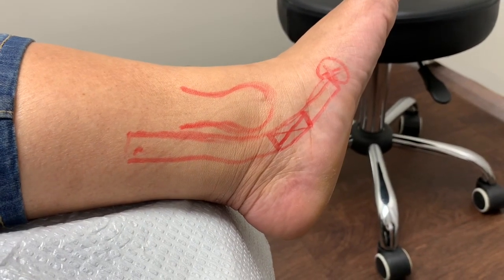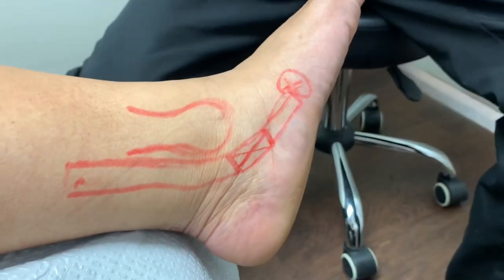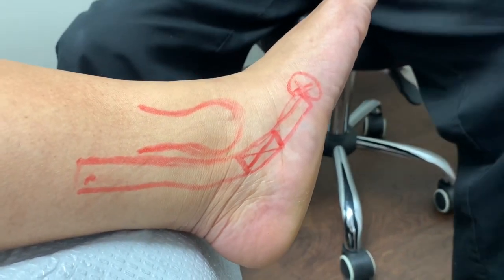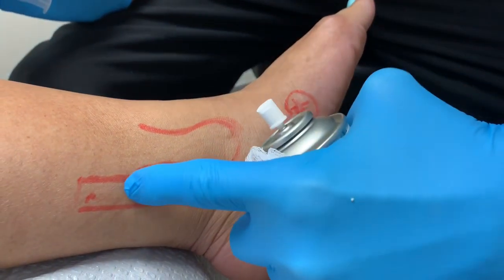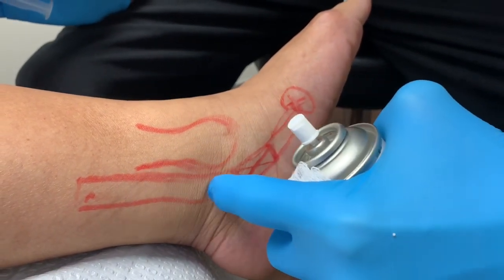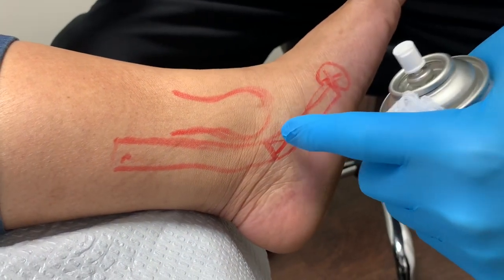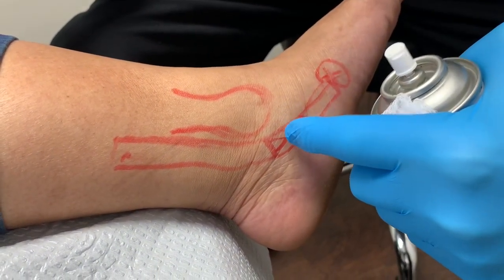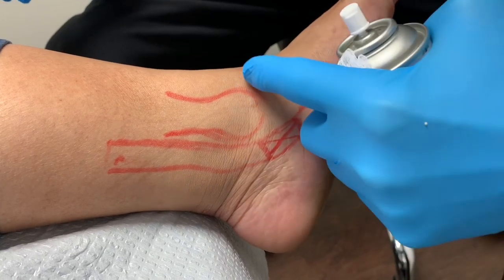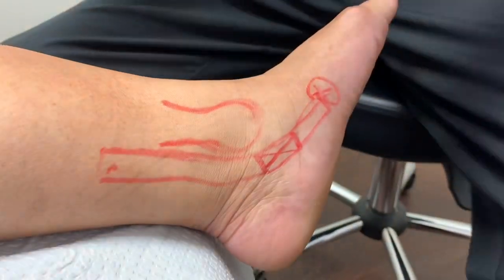We're gonna use a little bit of cold spray so she does not feel the stick. If the pain was more posterior here, I would probably defer the local anesthesia, but I know for a fact that we need to numb this area up here because it's really going to be uncomfortable for the patient.